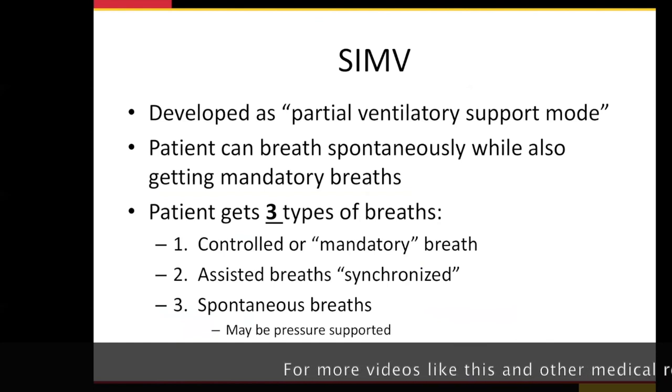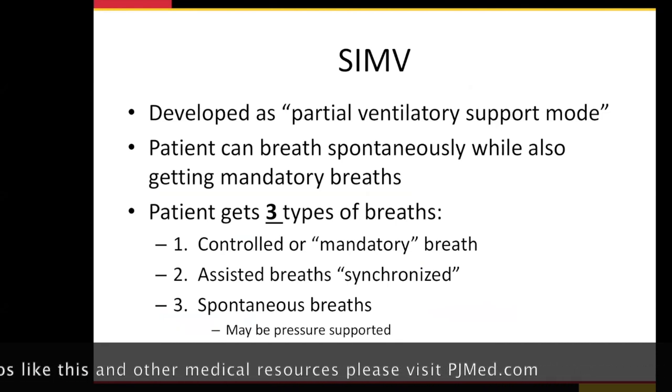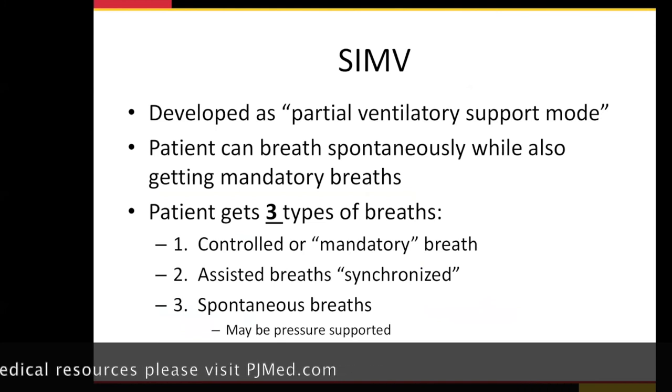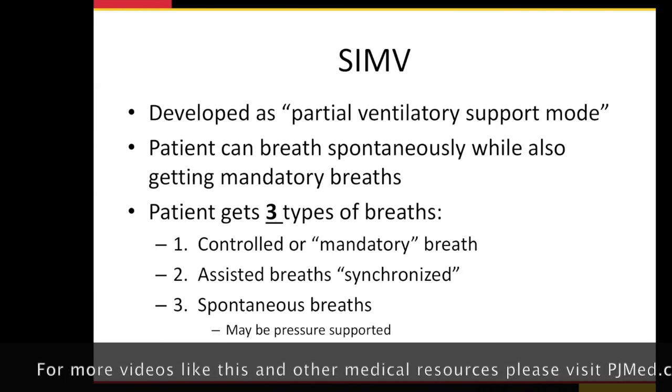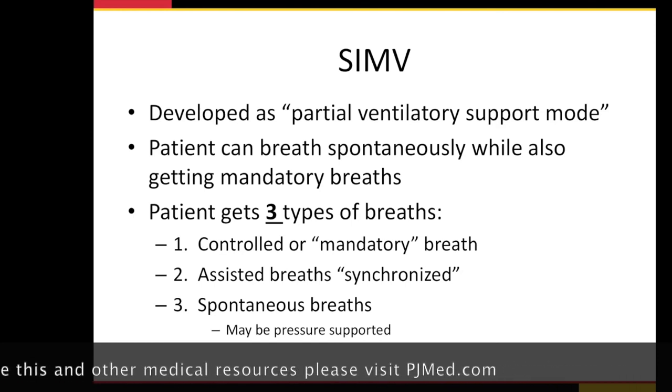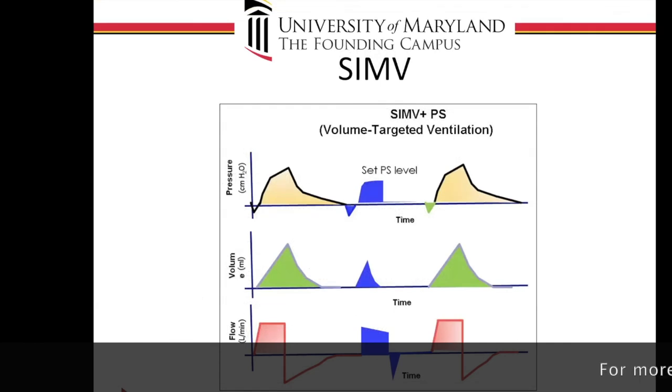So we like this for surgical patients because they go through their surgery, they're getting better, we want to wean them off the ventilator. So what we do is we just dial down the rate of how many mandatory breaths we're giving, and then they breathe in between. We see how they're doing. We continue to decrease the mandatory breaths, allow them to do more spontaneous, and then we get right to pressure support, which I'll talk about. So this is a way you can wean patients that you expect to get better. Most of our ARDS patients and COVID patients, you're not going to be on this mode right away. So I'll show it to you for completeness' sake, but this is how it works.